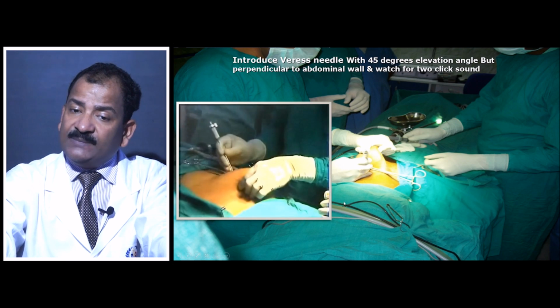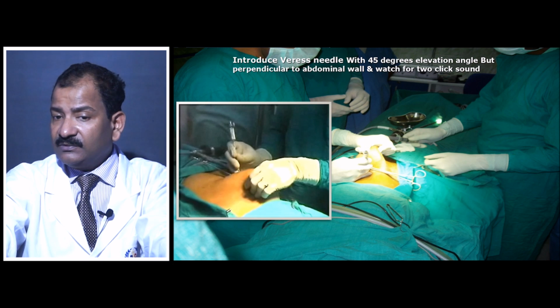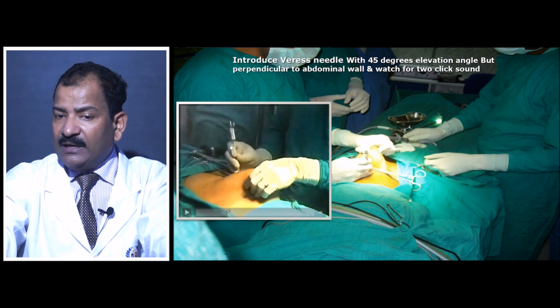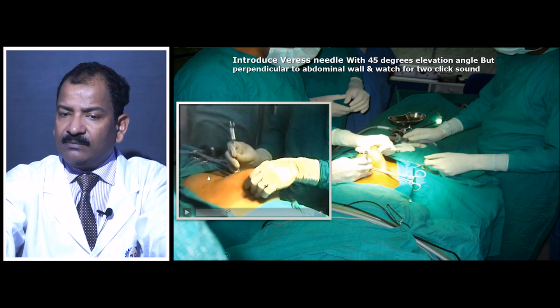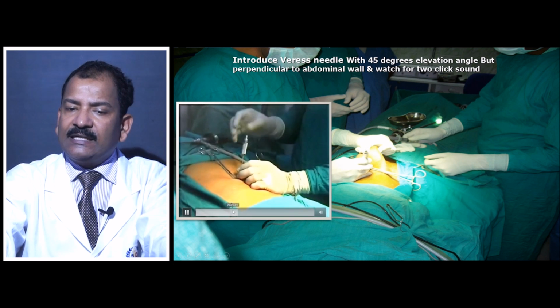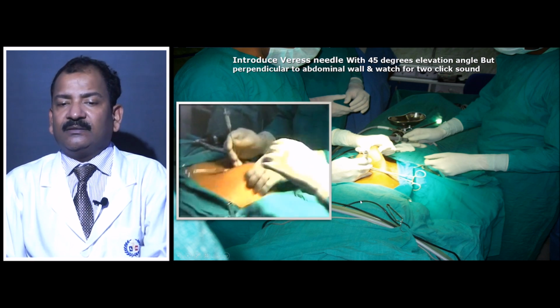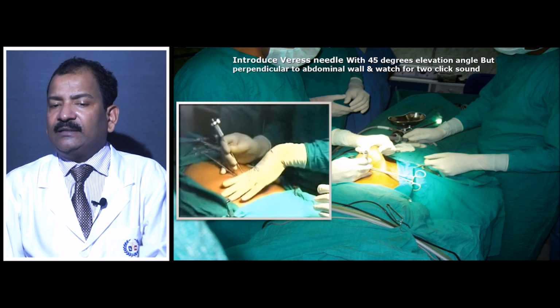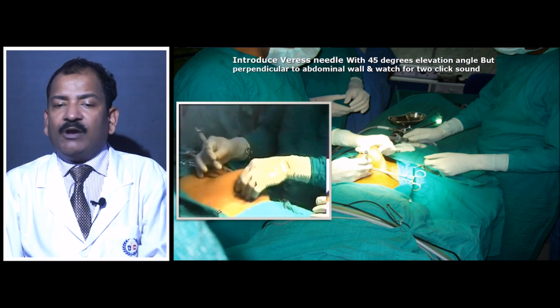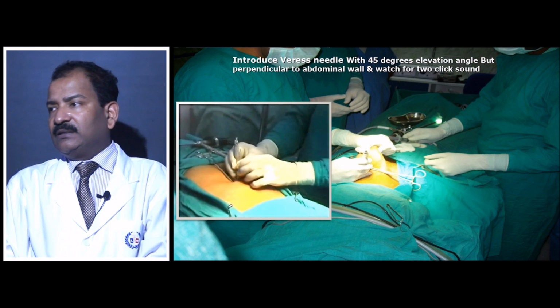If the patient is very obese, then ask an assistant to help you, and then it is perpendicular and 45. So, once you go, 1 and second click. Again we will see, lift the abdominal wall and then hold it, point towards the anus and 1 and 2 clicks, you are in.